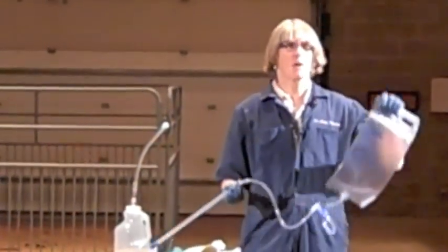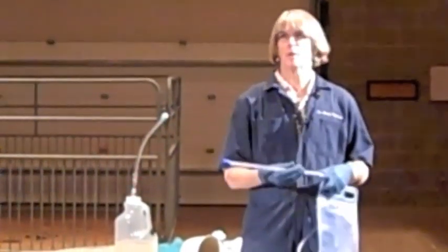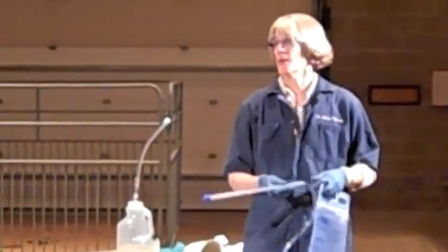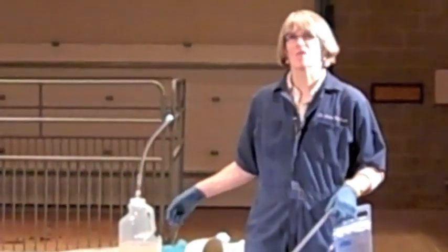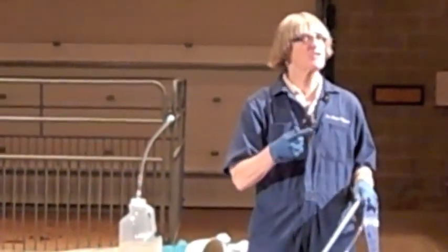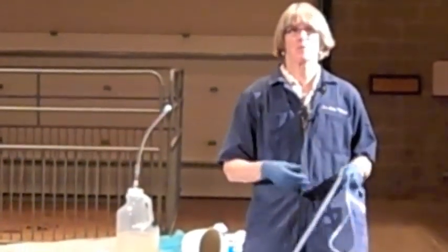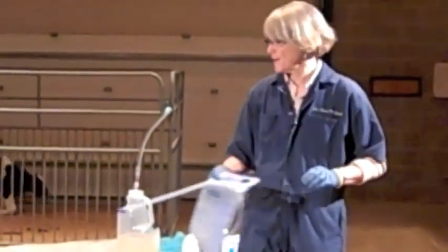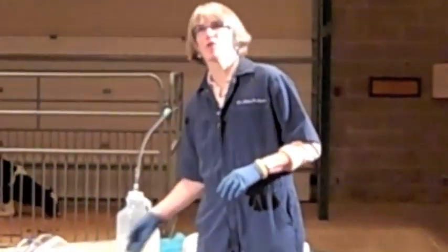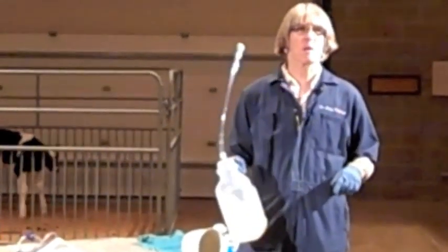Because people don't like to pass an esophageal feeder, I like to ask people to pass it only once. In the case of colostrum, we want to give four quarts. When we use the esophageal feeder, we're going to give a full dose all at once when the calf will absorb it. Unless it's a 60-pound Jersey, you have to use the big volume.